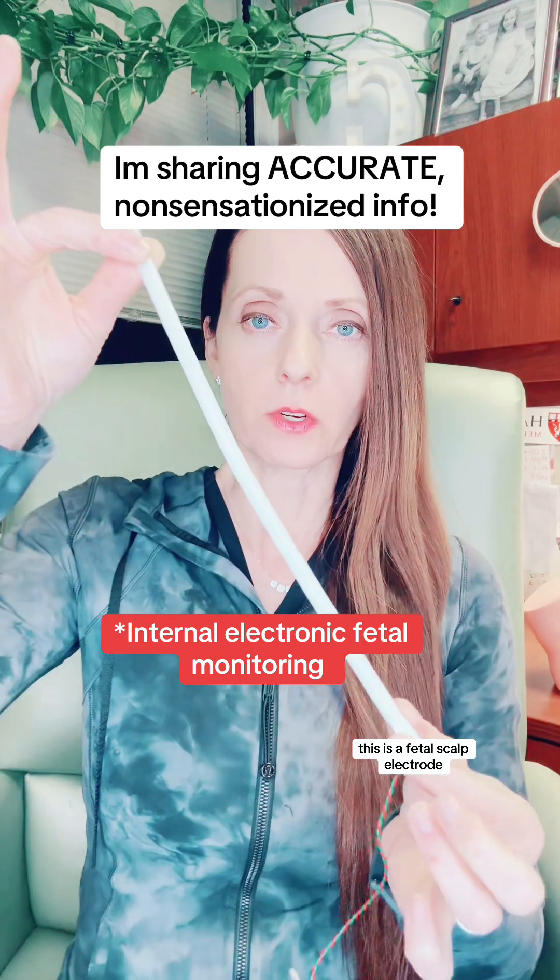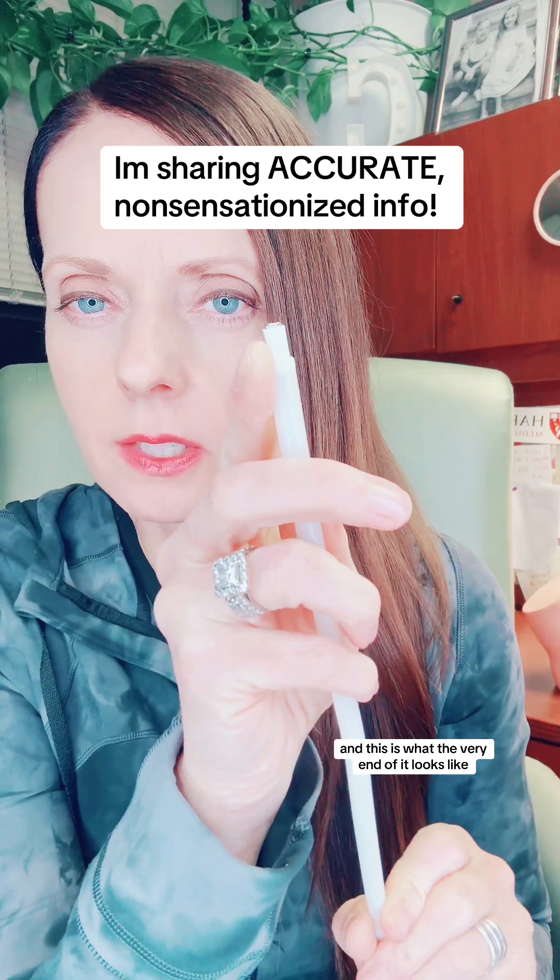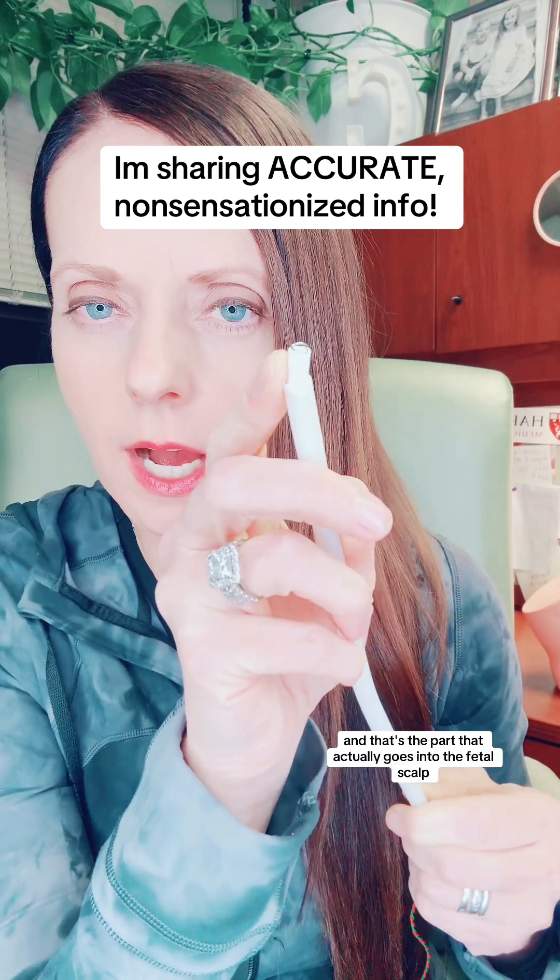This is a fetal scalp electrode and this is what the very end of it looks like — that's the part that actually goes into the fetal scalp. It's very, very tiny and also very shallow, but you can see that it's a spiral because it screws onto the top of the fetal scalp, but it cannot go in very far as you can tell. There's not a lot of wire there.